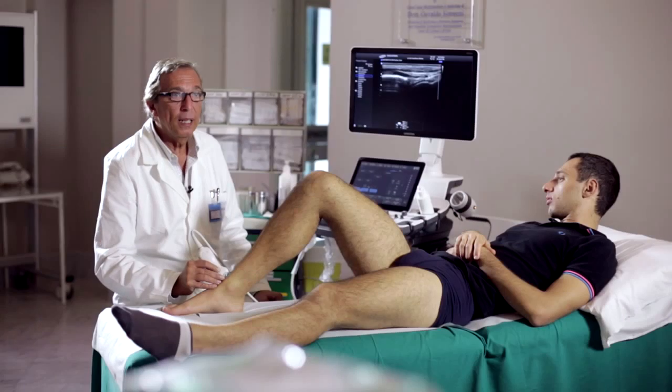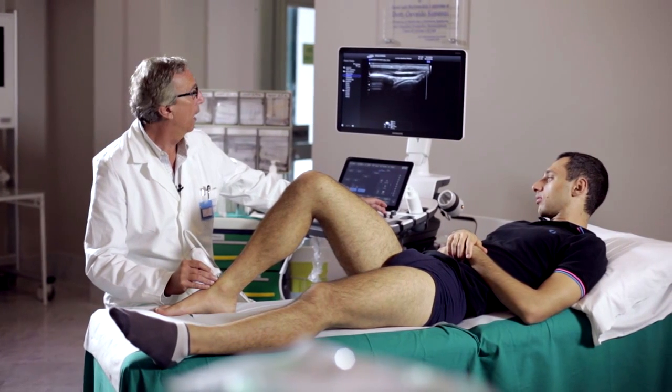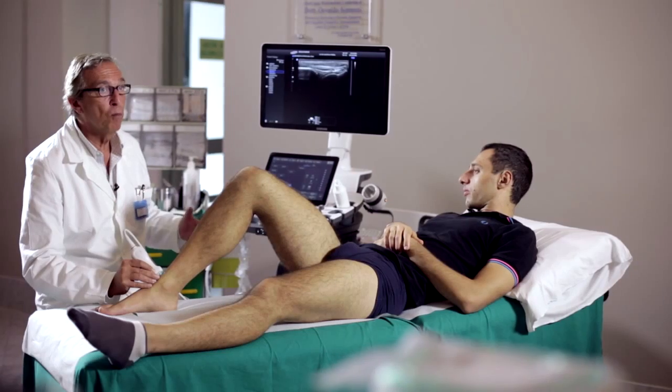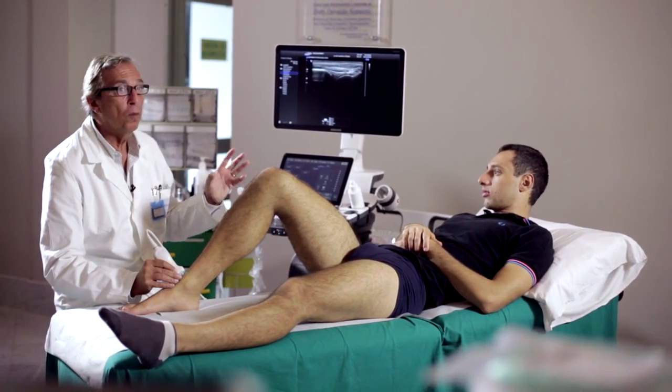Finally, an important structure to be looked at is the deepest part of the ankle at this level, and is represented by the anterior surface of the distal tibial epiphysis and the most anterior part of the talus, rather the two anterior components that form the tibio-talar joint.